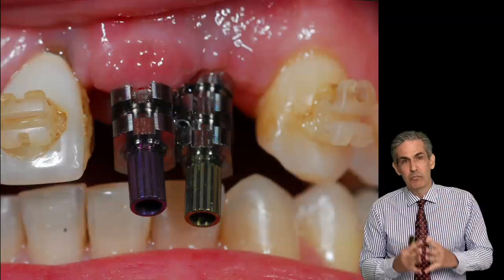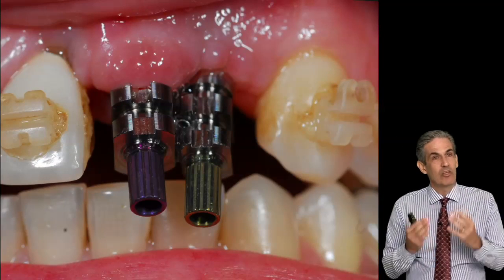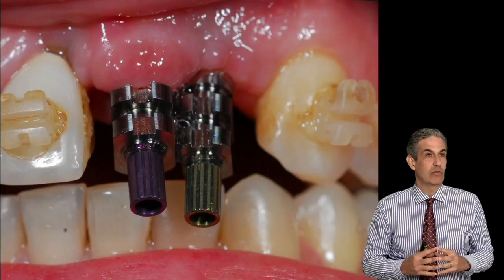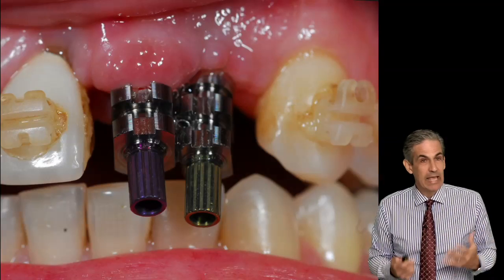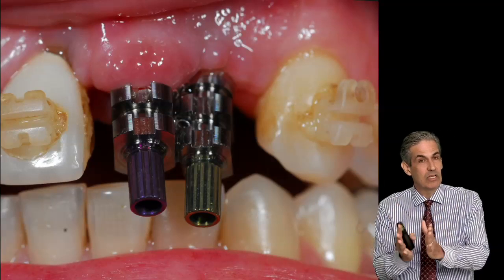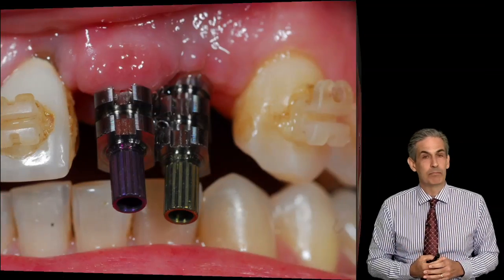Probably the most important thing for us to look at is the implications of implant placement when they don't meet our biologic goals. When the implants are too close together, what is our expectation? And of course, on this case, we don't have a dental papilla. How do we manage that? Can we manage it? Does the patient accept that? Do they want separate teeth or splinted teeth? All those things need to be really reviewed.